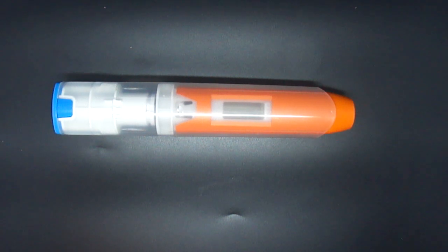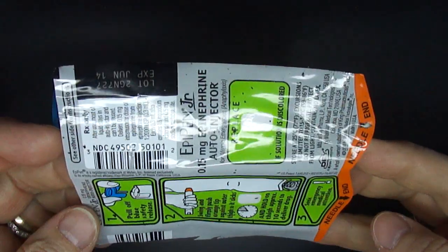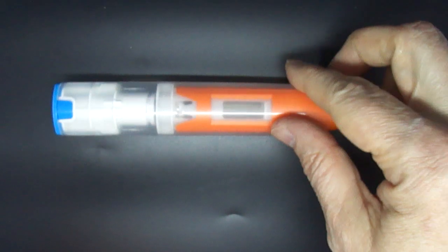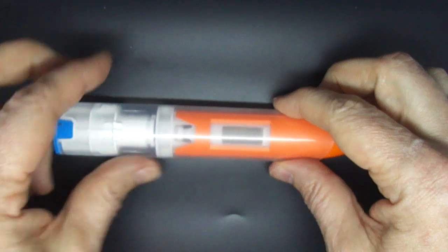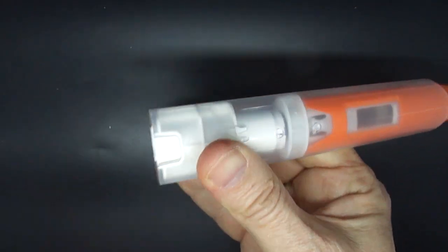This is an EpiPen Junior and I have removed the plastic cover so that you can see inside. I'm going to fire it off so hopefully you can see what happens as it fires. First I'm removing the safety cap.